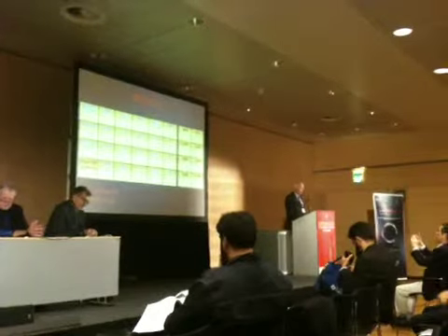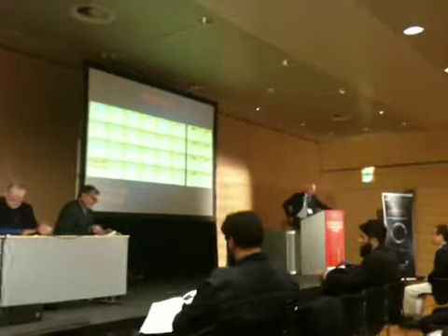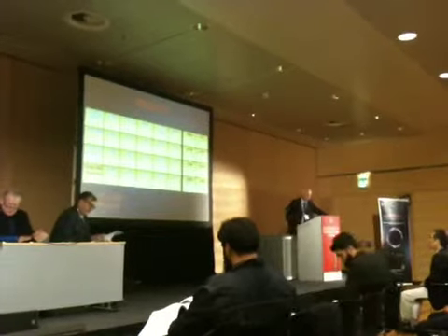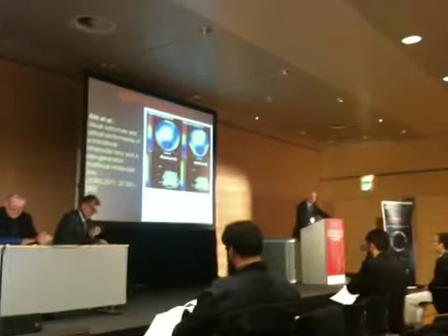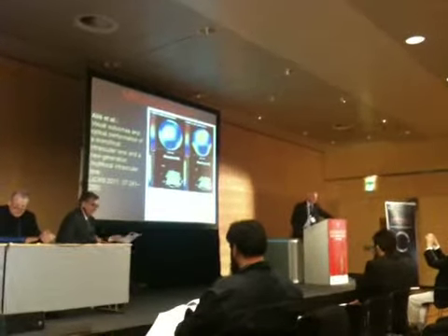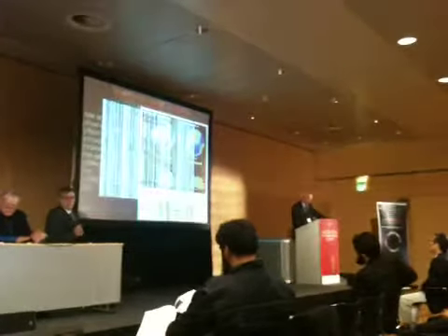As you can see, these are eyes in very good condition of health. They have a very good vision for far, a good vision for near, and a quite good vision for intermediate distance. I started this slide from a paper published by Professor Claudio, where he compared the monofocal IOL and this multifocal IOL. As you can see, the optical performances are quite good.